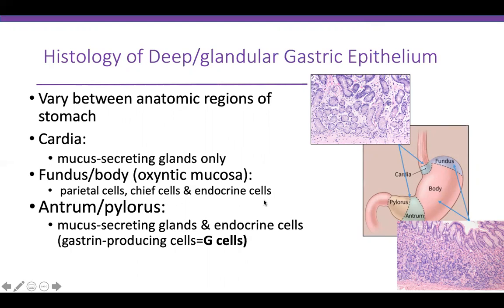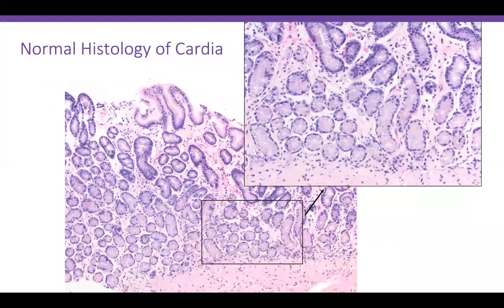This is the normal histology of the cardia. It is mucus-secreting lined — you have your surface gastric foveolar epithelium, and the deep glands are mucus-secreting. As you can see at high power, the cells have clear cytoplasm.